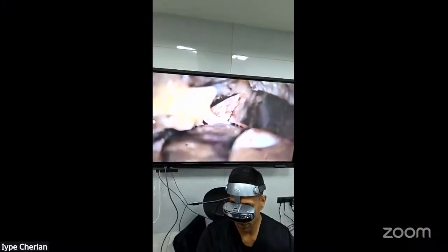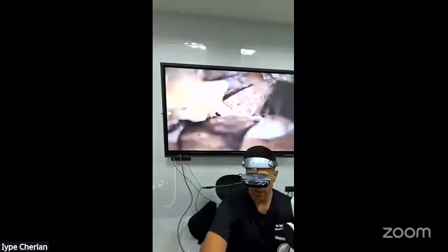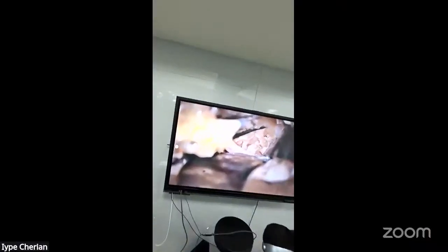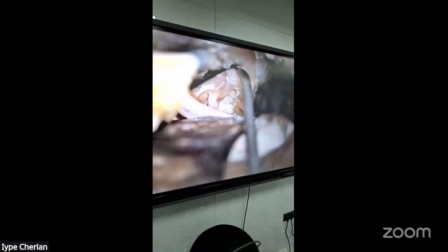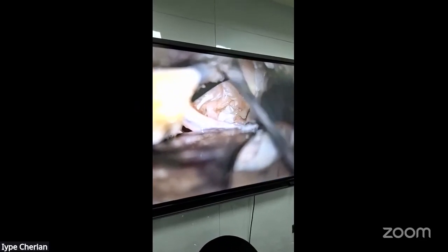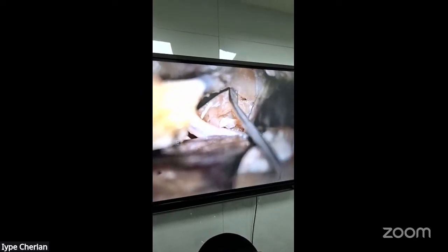I know you're pointing it out. The retractor will come up like that. Just stay there. Can you have someone go to the wall? Just give me another dissector. Vikrant, you have to see, here is the sixth nerve. I'm going to show you the sixth nerve.